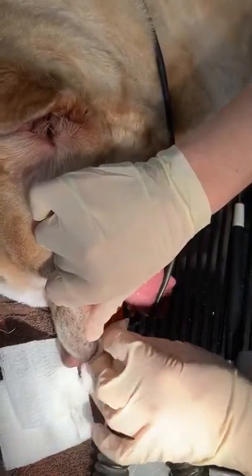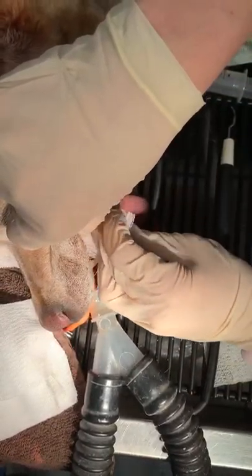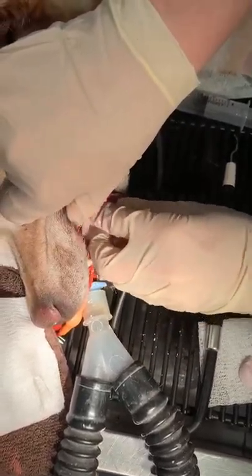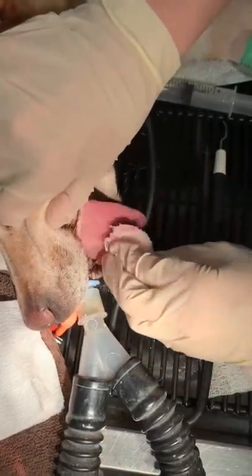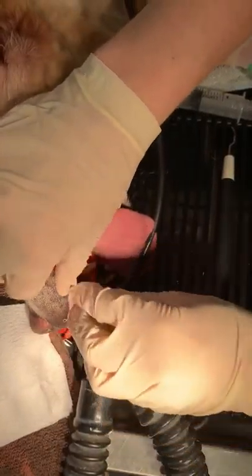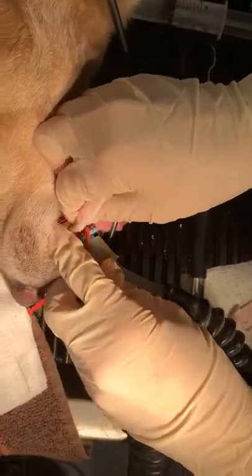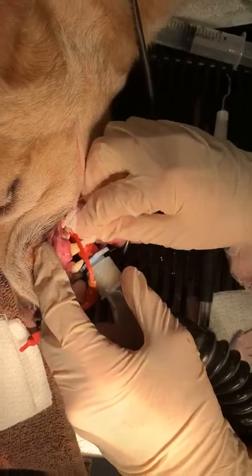If I was going to polish the bottom or even scale the bottom, I would do all the scaling before doing any polishing. But assuming this was near the end of the procedure and I've done all my polishing entirely, then what I want to be looking for is any chunks of tartar on their tongue or loose on the gums, and I'm rinsing those out and wiping it clean.